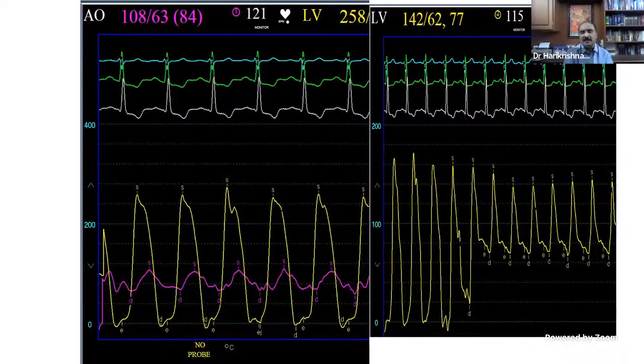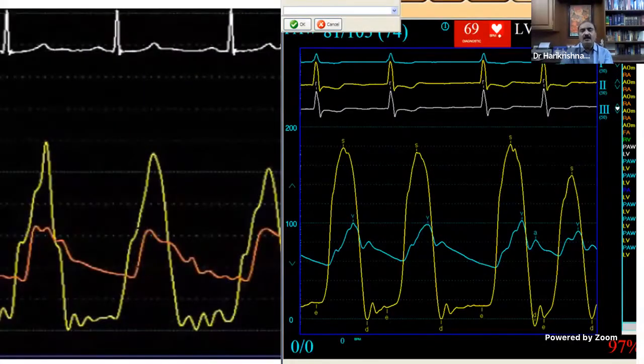Carabello is when the catheter is across the aortic valve. Sir, that's peripheral augmentation, sir, as we are moving from the proximal to distal. What is that? Something has recovered. Yeah, correct. Pressure recovery. It's called pressure recovery. Okay. Carabello, I will come to subsequently. Carabello is different. Okay. So these are two pressure tracings. The patient is having LVOT obstruction.